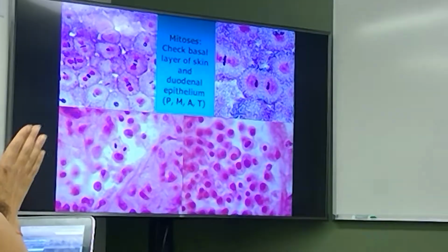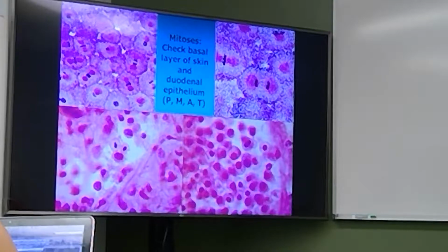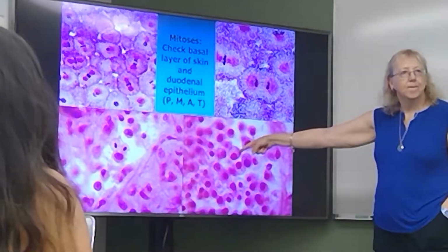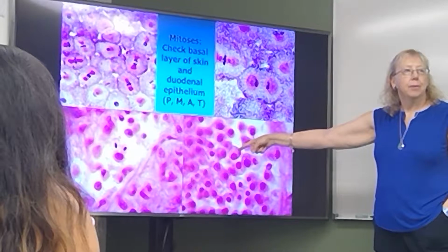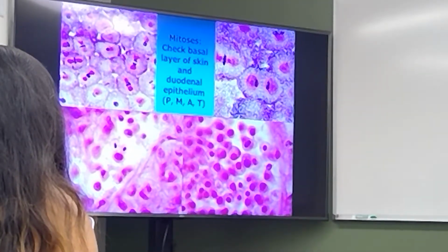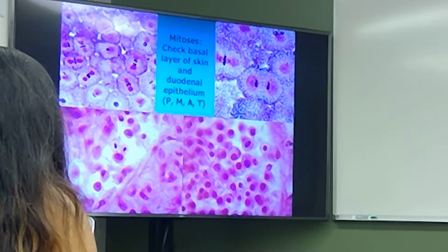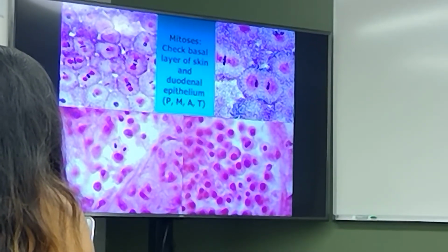However, there's something unusual that I discovered in these clams from the Chesapeake Bay. Anybody tell me what's going on with this cell? Right. This is a cell, it's got cytoplasm, and it has a red nucleus, a pink to red nucleus. Why? Well, I started calling this rosy cell unknown, and our current hypothesis is that it is maybe an amoeba.